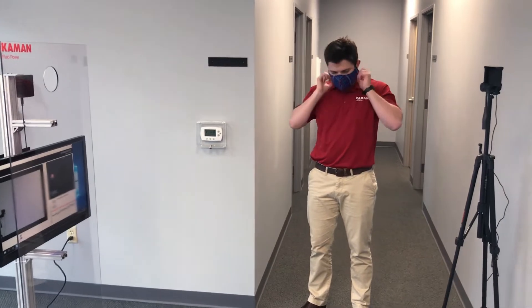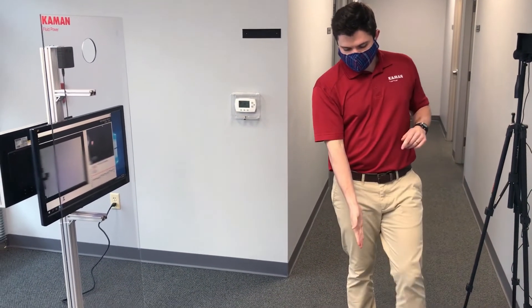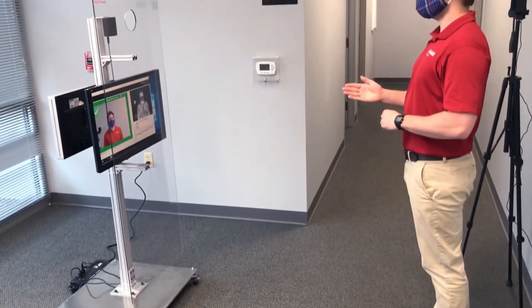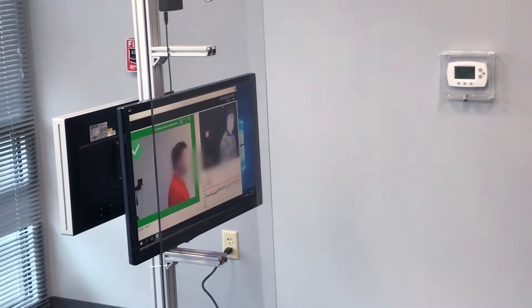Employees have their masks on and they remove their eyewear, then they step on a spot measured out five feet from the camera. They get screened — look at the camera. I just showed 97.1 degrees Fahrenheit, not feverish, so I move on and I start my shift.